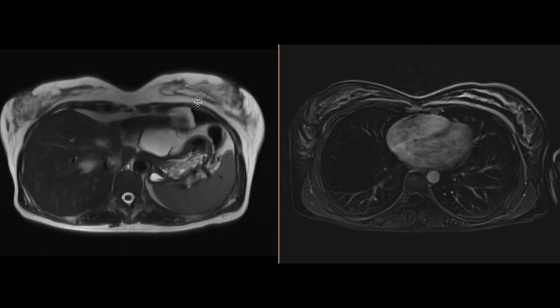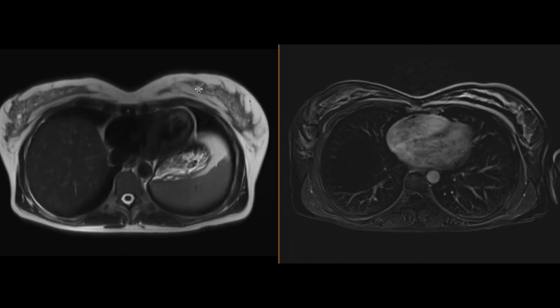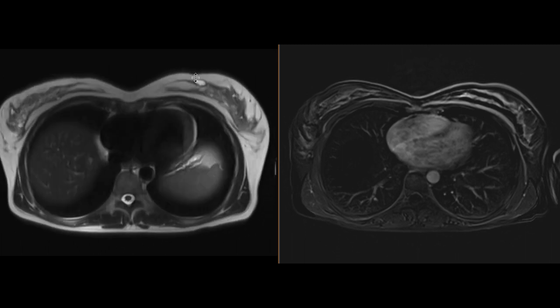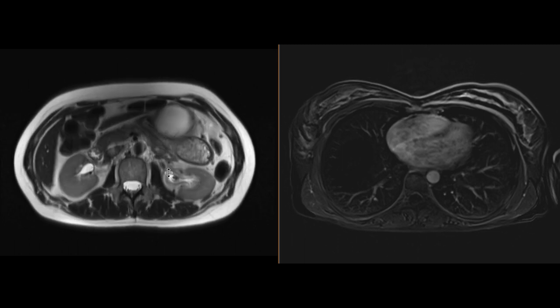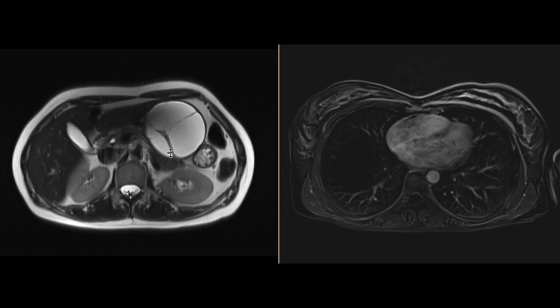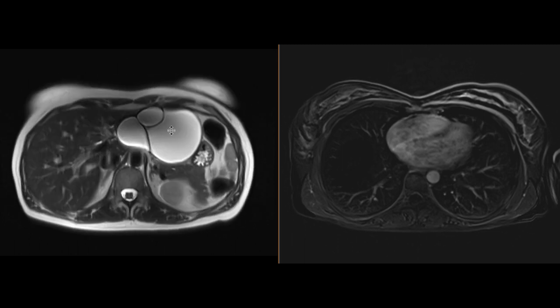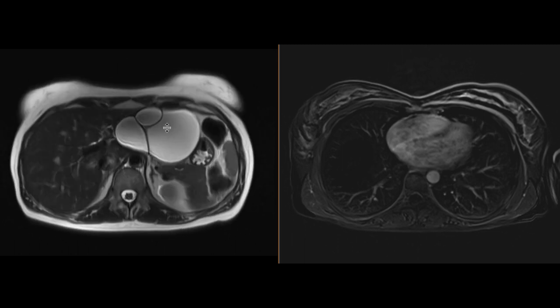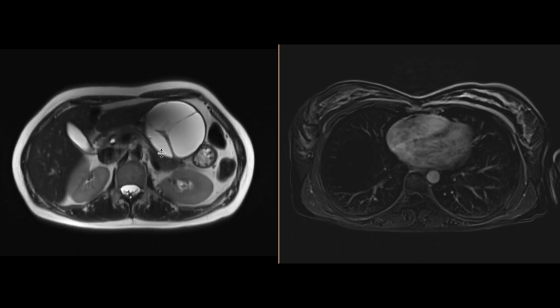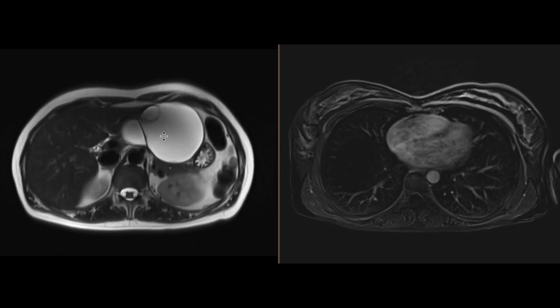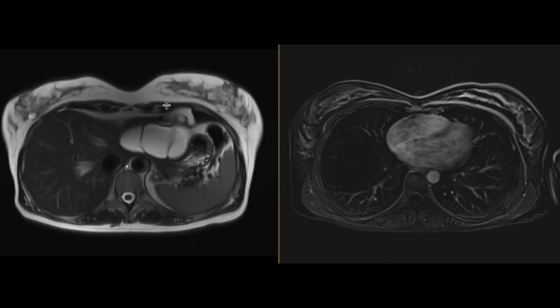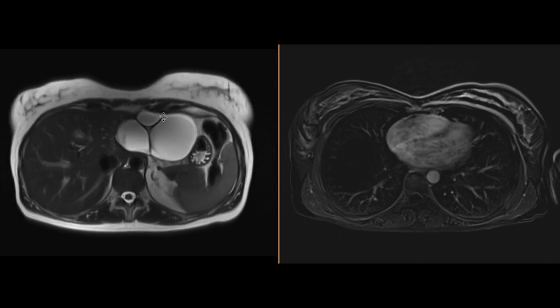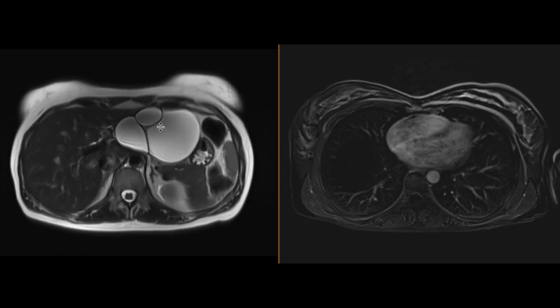We notice that it's a solitary mass, and that there's no other solid or cystic mass, at least on these T2-weighted images that we can see in the left hepatic lobe. There's no biliary ductal dilatation, and no definite communication with the ducts, at least on this sequence.